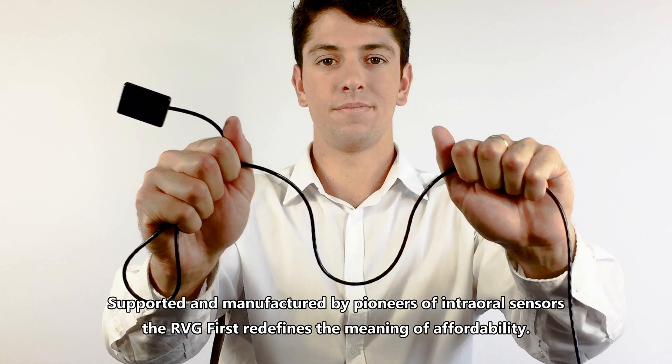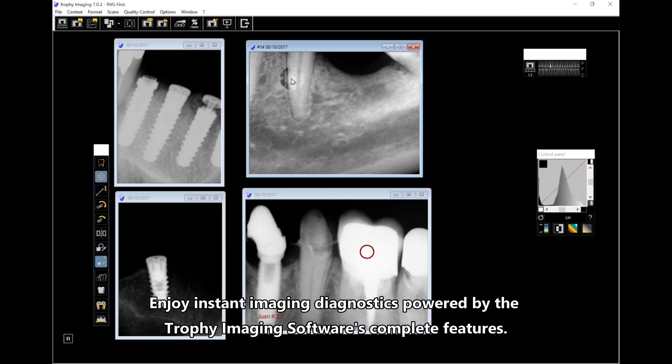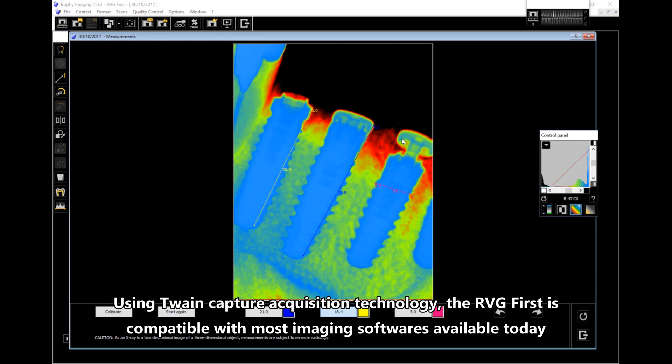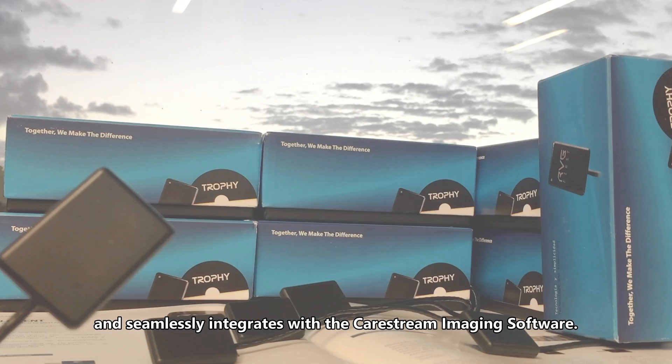The RVG First redefines the meaning of affordability. Enjoy instant imaging diagnostics powered by the Trophy imaging software's complete features using twin capture acquisition technology. The RVG First is compatible with most imaging softwares available today and seamlessly integrates with the Carestream imaging software.